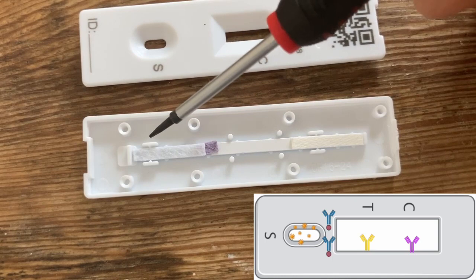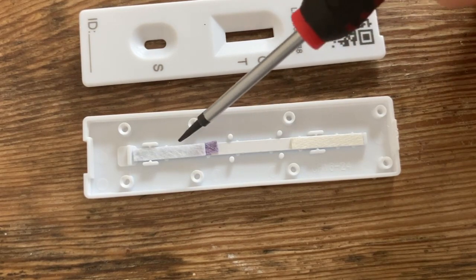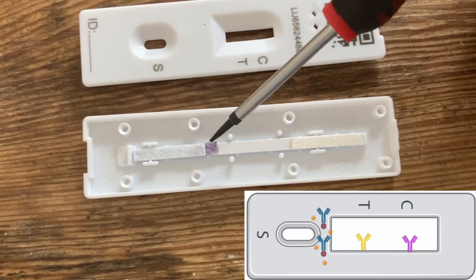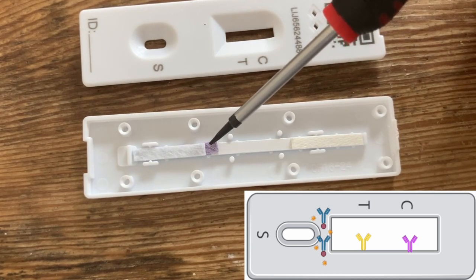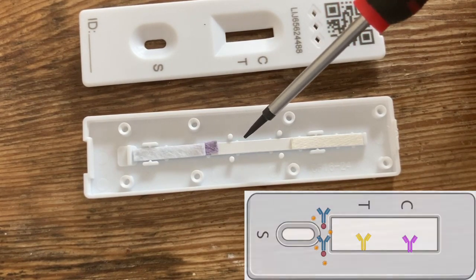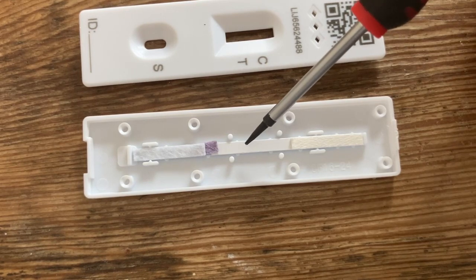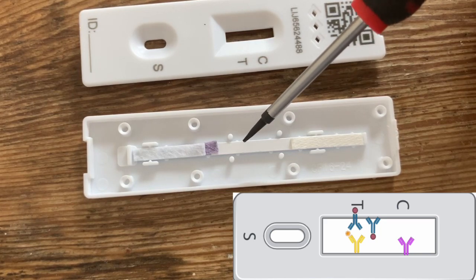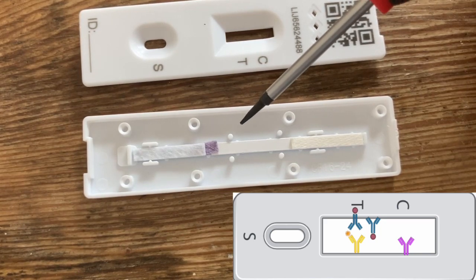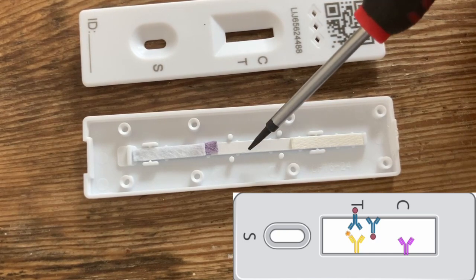So how does this all work? When we put a sample on here, it starts to wick up the lateral flow test. The sample then picks up these red labelled antibodies, and those antibodies will bind to the virus — some of them of course won't bind — but everything will carry on flowing up the pad. When they get to the T, the test line, the antibodies that are bound to virus will bind there. So now we have the antibodies that are stuck on the nitrocellulose, bound to the virus, which are also bound to the labelled antibodies they picked up — which means that gold label gets stuck at that point.